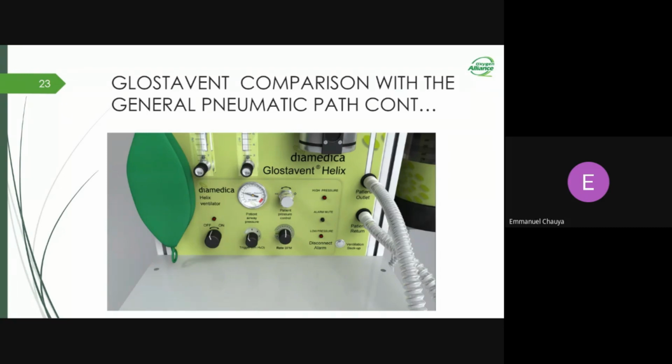On the interface down there, this is where you have most of your electrical and, of course, partially the pneumatic control. We'll start with the left corner, and this one is the on and off knob. You rotate it to the on position, you switch on all the electrical connections. And the next one is the trigger knob. This is where you set your threshold for the pressure alarm, whether it should buzz and light up at 5 centimeters or any other set threshold.